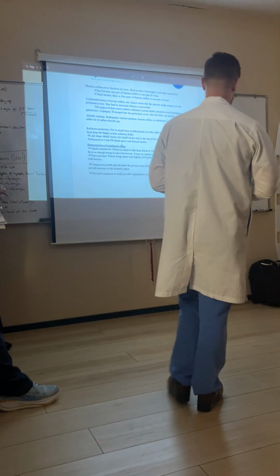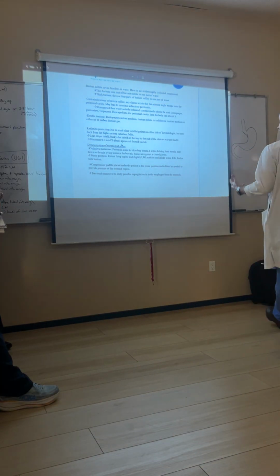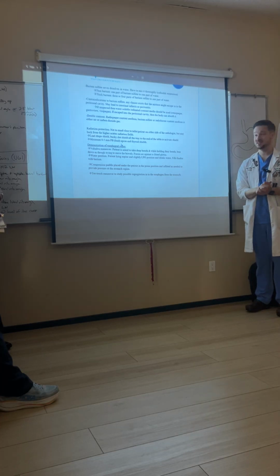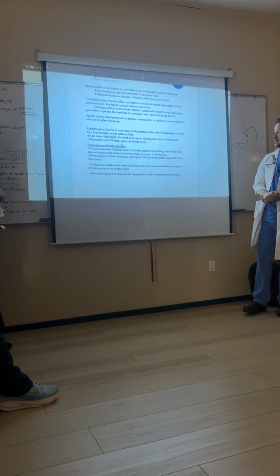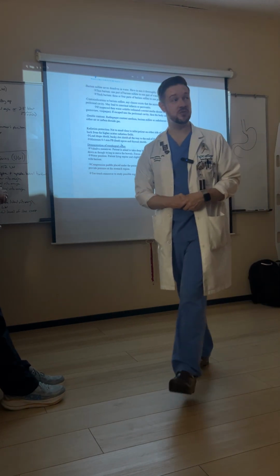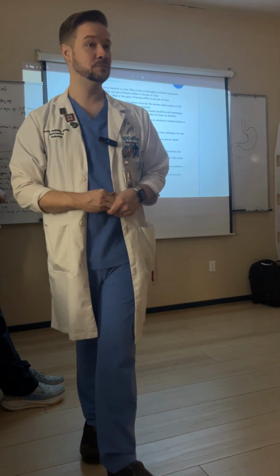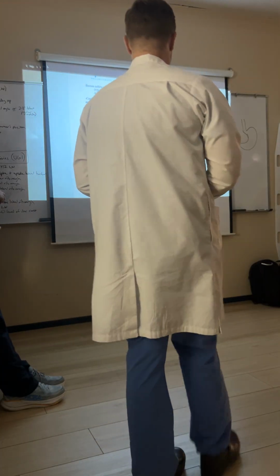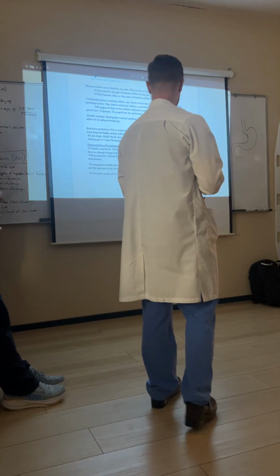And the radiologist is going to test for that in a few different ways. They may do the Valsalva maneuver, where the patient is asked to take a deep breath, and while holding their breath, they're going to bear down as though they're trying to move the bowels, okay? So they're trying to go, which forces air against a closed glottis.